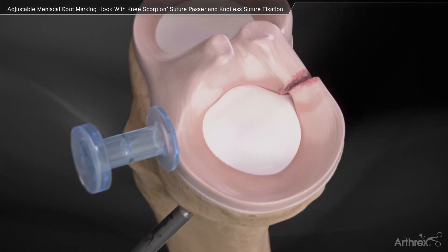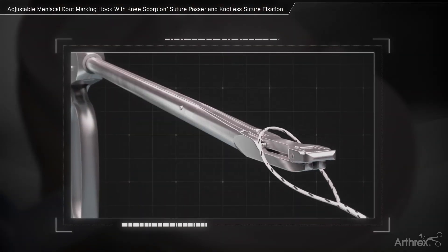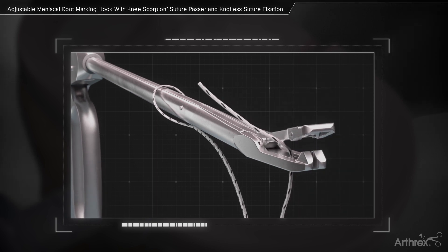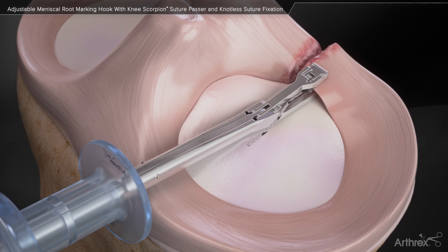Place the shaft of the Knee Scorpion through the loop of a size zero fiber link and load the free end of the suture into the bottom jaw for suture passing. Introduce the Knee Scorpion with the suture loaded into the joint space through a passport button cannula.